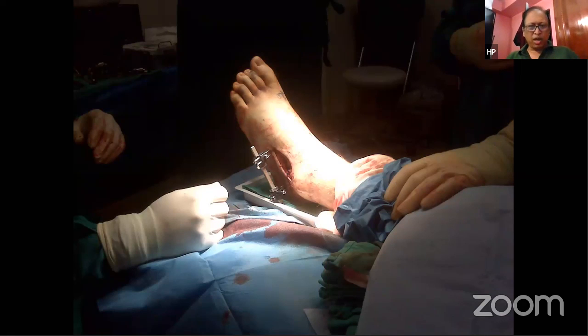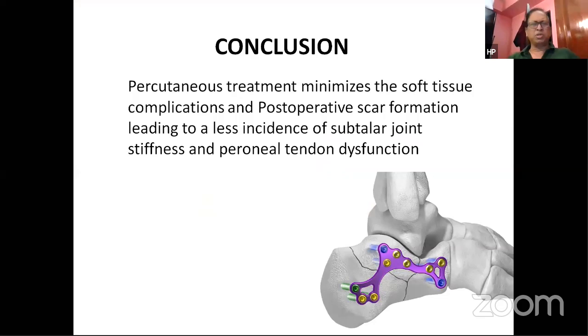So this is another way of treating with an X-fix, which Dr. Mandeep Dhillion has already suggested. And so in conclusion, percutaneous treatment minimizes the soft tissue complications and postoperative scar formation, and it leads to a lower incidence of subtalar stiffness and peroneal tendon dysfunction. Thank you very much.